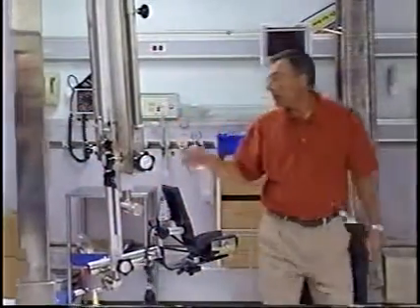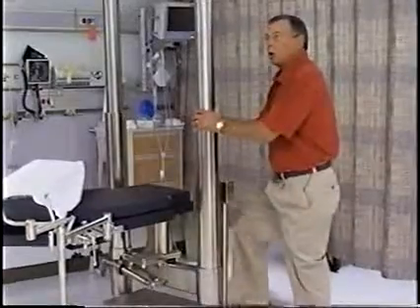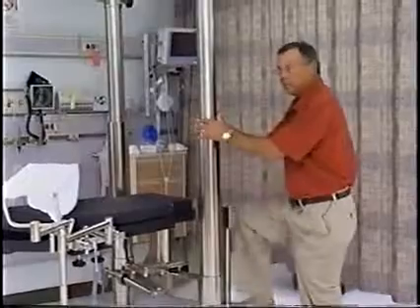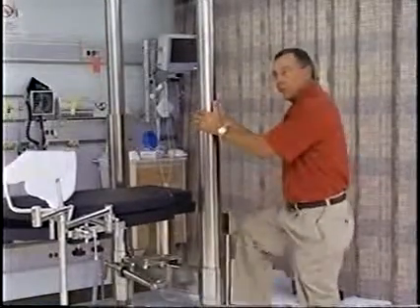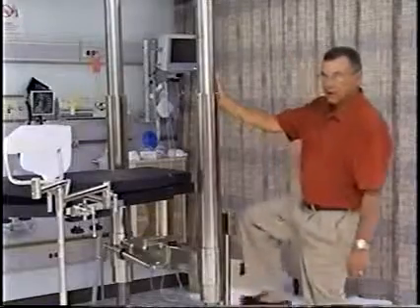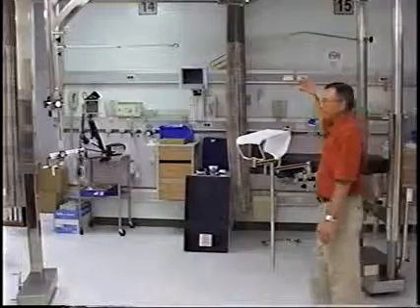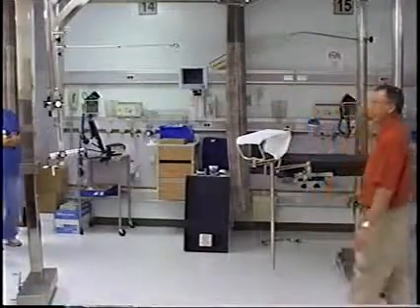And the only other thing you didn't do, Michelle, and I didn't do this either, is that for a hip, the doc is going to want the table pumped up as high as it will go, because he wants to be able to look straight into that hip. It's so important that those surgical lights are in the right place before you start pumping this table up. Because if they were over there, you'd have to lower the table, move the lights, and the doc's not going to be happy.